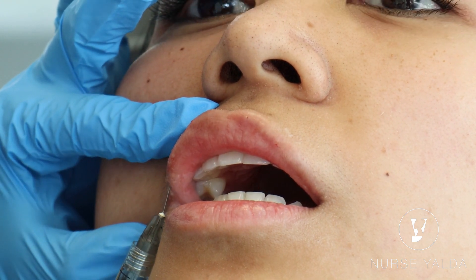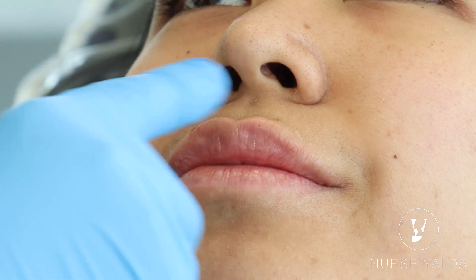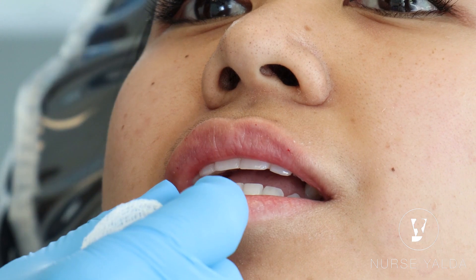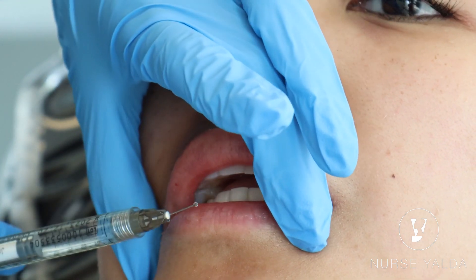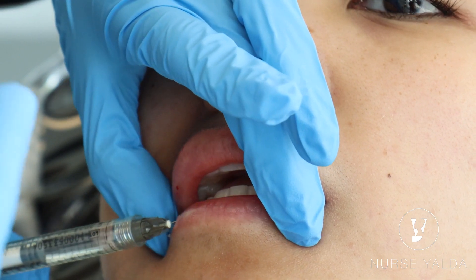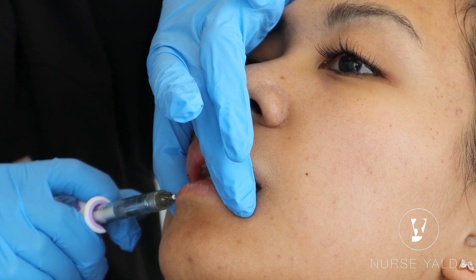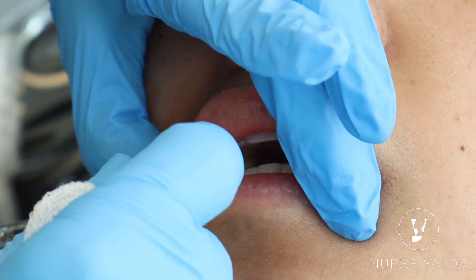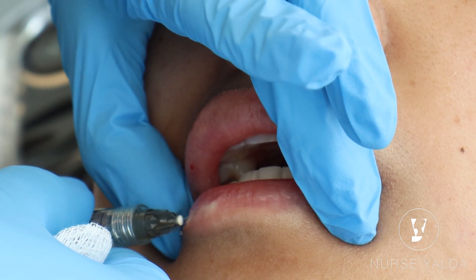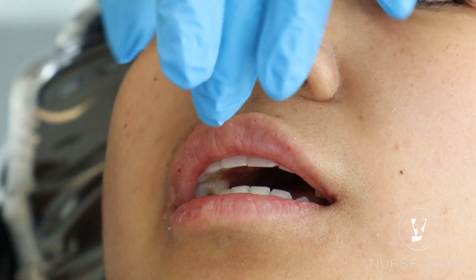Good job. Now gently, we're going to do a little massage. Then we do the same thing — not too deep, not too superficial. The anatomical area here is the superior and inferior labial artery, so retrograde with a small amount. Since you want the center, the middle portion of the lip to be more juicy, you can add a little more right there — beautiful.